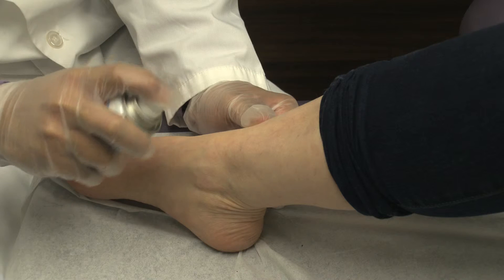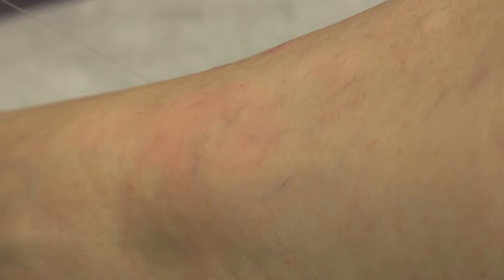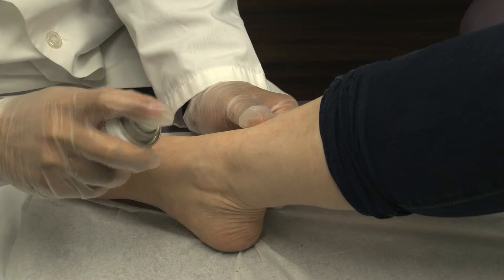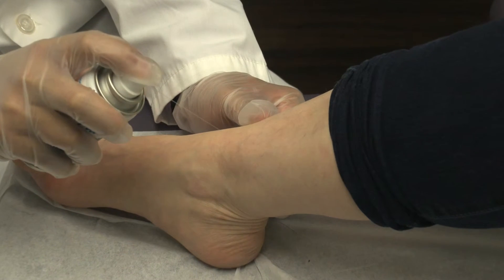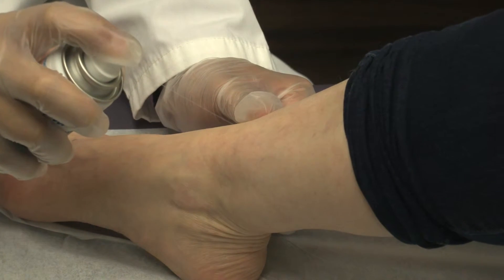Spray the area to be treated with a topical freezing agent. Spray between 5 to 10 seconds, depending on the area size. During the procedure, make sure the skin is kept cool at all times to avoid epidermal damage.